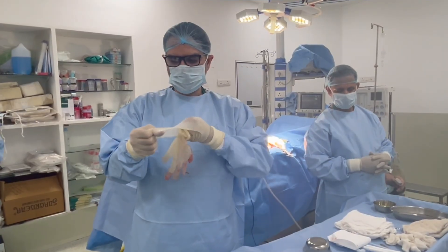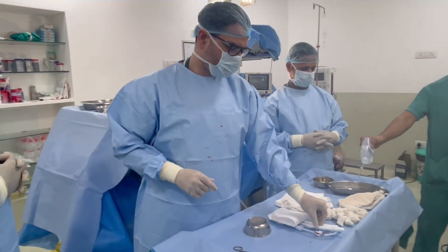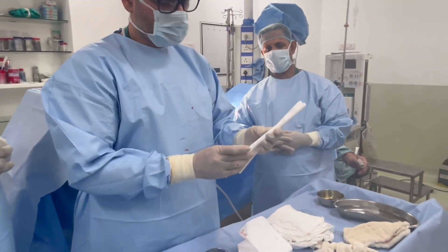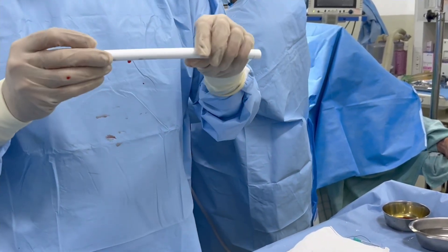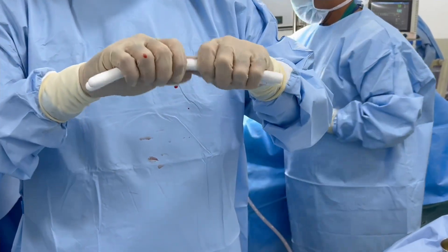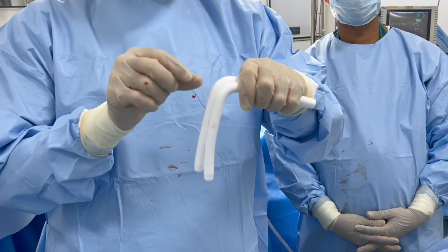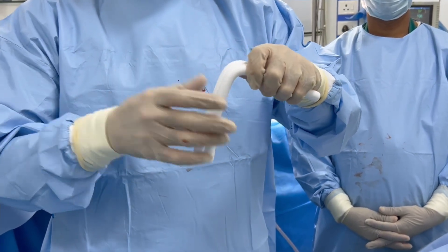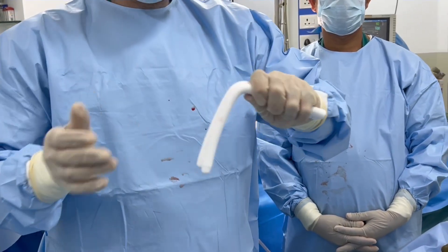Before opening the implant, we remove the bloody gloves and handle the implant with clean gloves. These are two 13 mm implants — it's a big implant. If you keep the two implants together, the rigidity is good. There is also a bend and a memory — there is a nitinol core. The implant can be bent down and it will stay down. It's not like the Indian implant that springs back. When you have sex, you can make it straight, and otherwise it will always stay down.